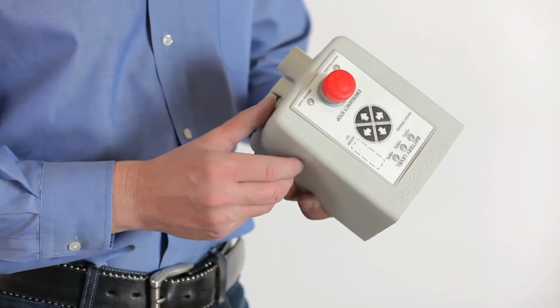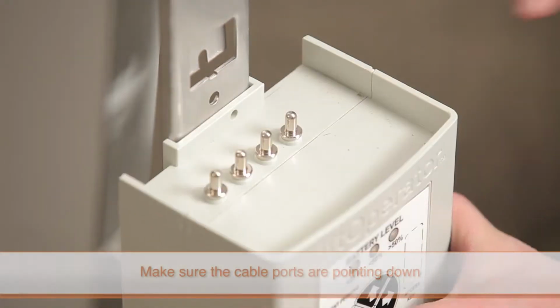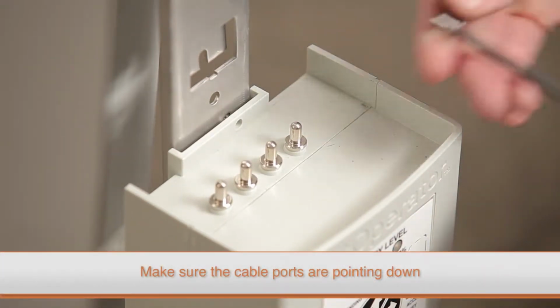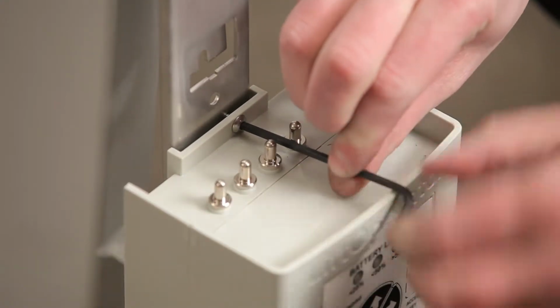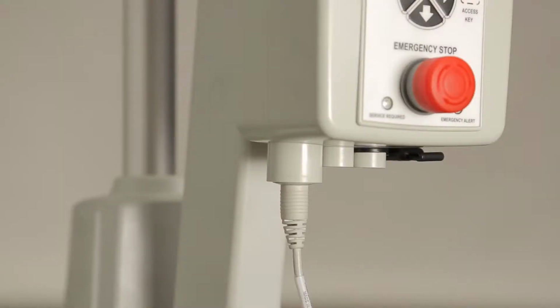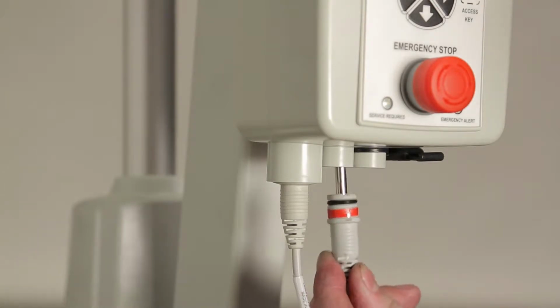To install the new control box, place it on the mounting plate with the cable ports pointing down. Then slide the box down so that it is secured by the tabs at the end of the mounting plate. Replace the torque screw on the top of the control box and securely connect all of the cables.